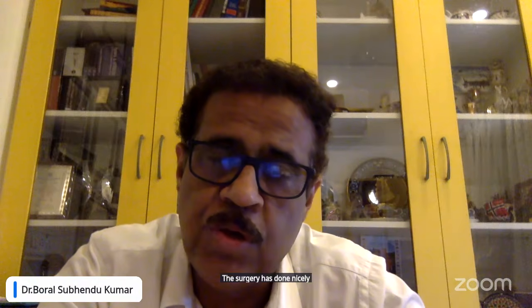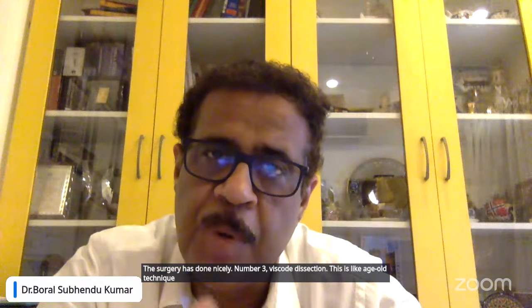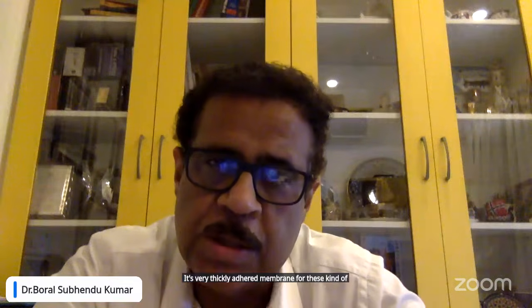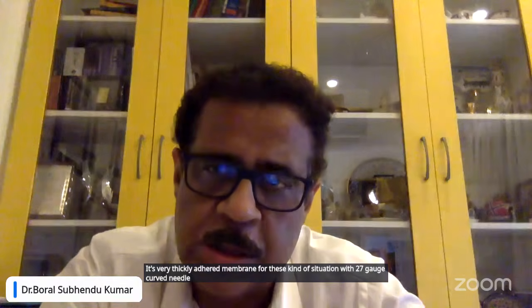Number three, viscodissection. This is an age-old technique, from long back, but I will prefer this viscodissection technique to separate the membrane from the underlying, very thickly adhered membrane in this kind of situation, with a 27 gauge curved visco cannula needle. I can do this viscodissection.